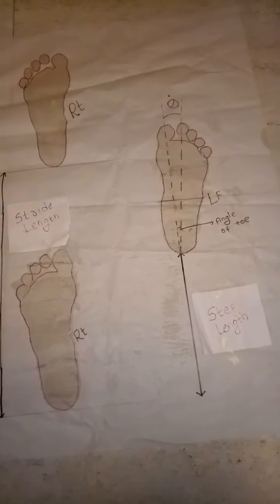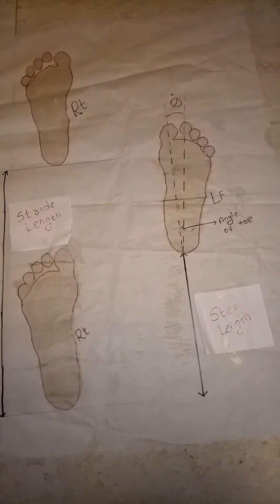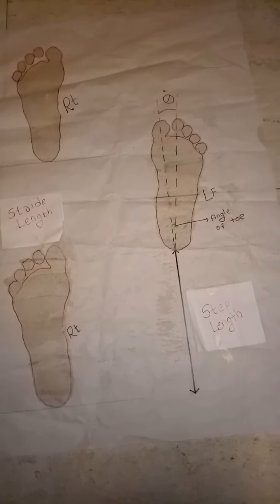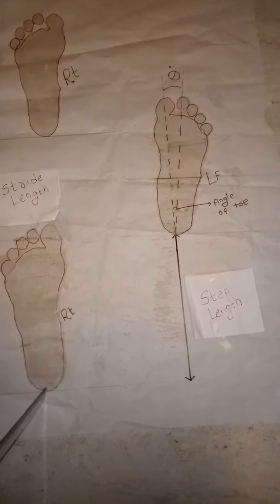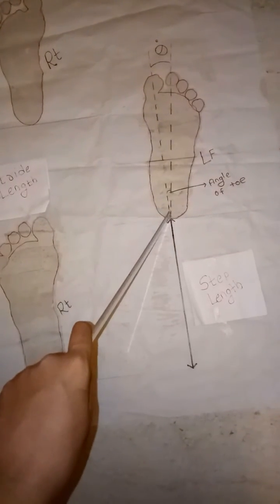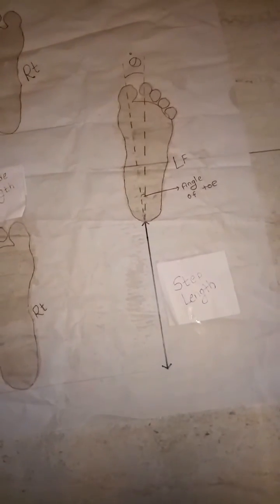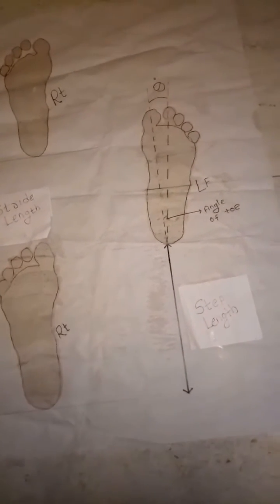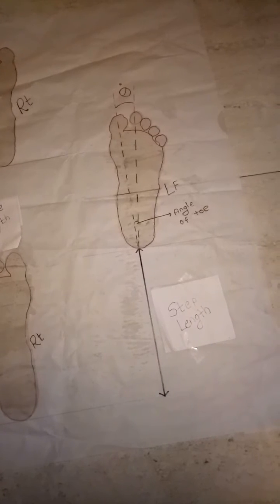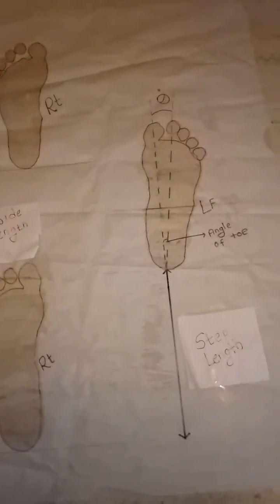Now we will proceed for the measurement of step length. Step length is measured from the heel strike of one extremity to the heel strike of the opposite extremity. A comparison of the right and left step length will provide an indication of gait symmetry. This is the use of gait measurement.